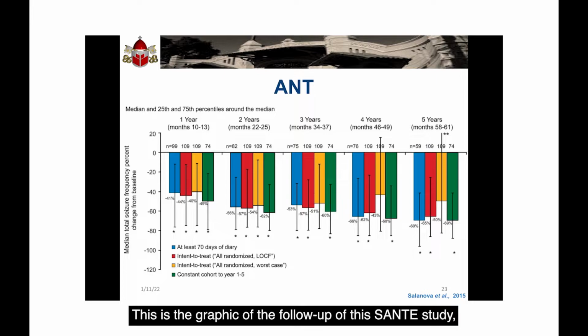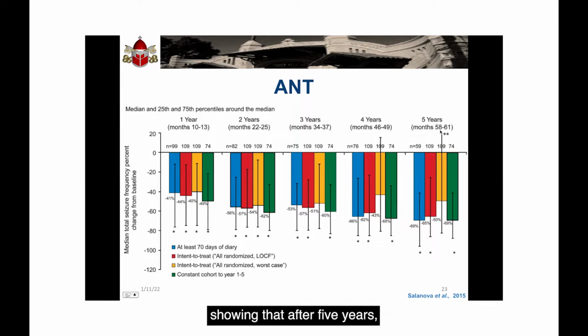This is the graphic of the follow-up of the Santé study, showing that after 5 years, the 74 patients that were still being followed showed almost a 70% improvement. What is interesting and should be highlighted on this graphic is that the improvement in seizure frequency was progressive over time. And this is something that is generally seen with neuromodulation.